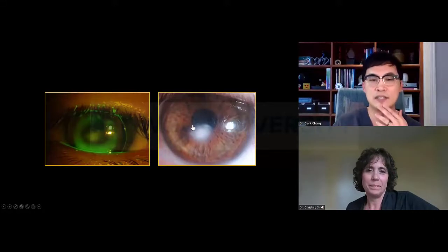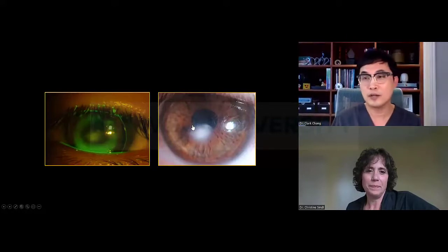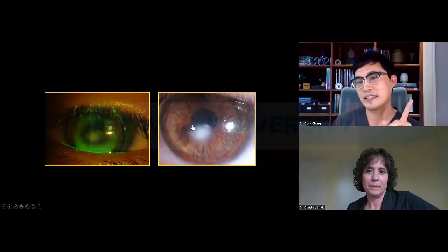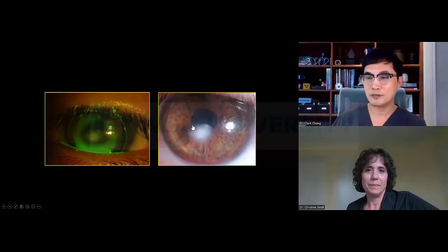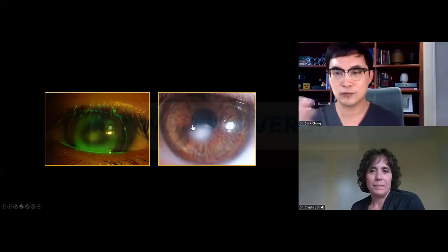So we can see in the incoming lens that the patient is wearing for the first visit, yeah, I see there's corneal central bearing that I normally would hope to avoid if I could. And there's that white opacity on the cornea that sort of corresponded with his intake of saying, I already know that I have corneal scarring, except when I looked at the slit lamp without the lens more closely, I thought, that's interesting, because we already talked in different lectures about clinically non-inflammatory findings for keratoconus patients.